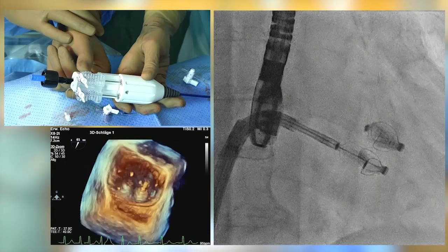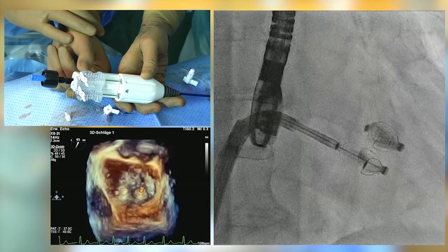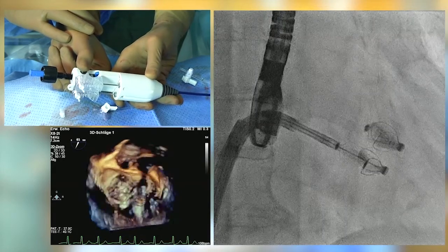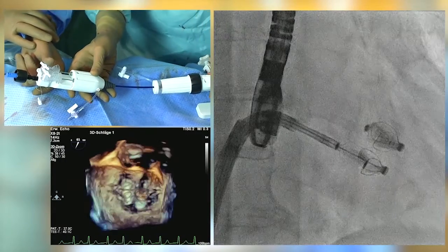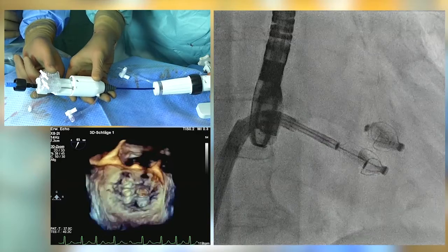As you've seen, clocking is really important. These are minor adjustments which can make a difference. So the device is in the right position. The clocking is correct, which is slight change here, slight torque towards counterclockwise to have it really 6 to 12 o'clock.